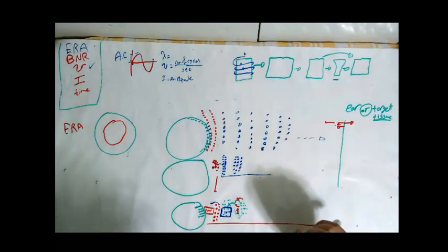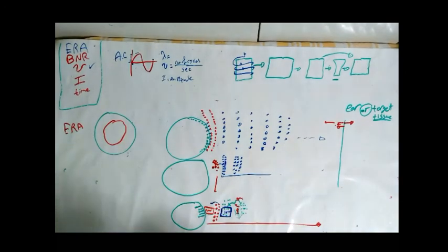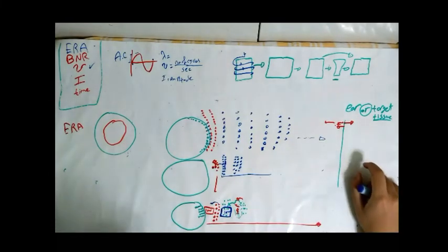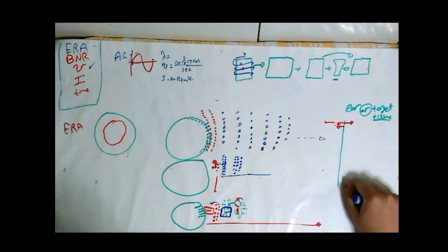If I blow up slowly, it will increase in size. And if I move my mouth away, it will shrink again. But if I blow it up very large, it will explode. This is the same mechanism as the non-thermal effect of ultrasound. We call it ultrasound cavitation.